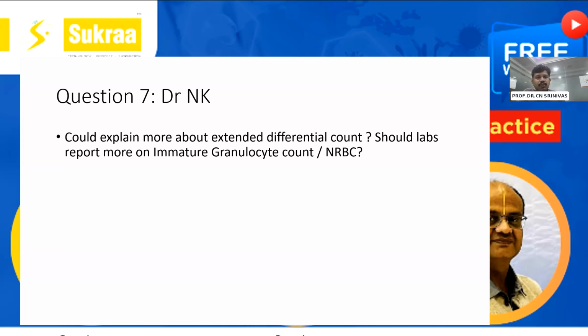Great. So when we do the immature granulocyte count from the analyzers, the blasts are excluded. Am I right? The blasts are not coming into the immature granulocyte group. Exactly, it has been stressed many times that it starts from promyelocyte, myelocyte, and metamyelocyte. So the clarity has been given that blasts do not come under this group of immature granulocyte count. Correct, doctor? Exactly, sir. So whenever there is a flag of a blast, or even when there is a shift to left, we will definitely have to look for blasts, and if present, mention them separately. Good. That's nice.